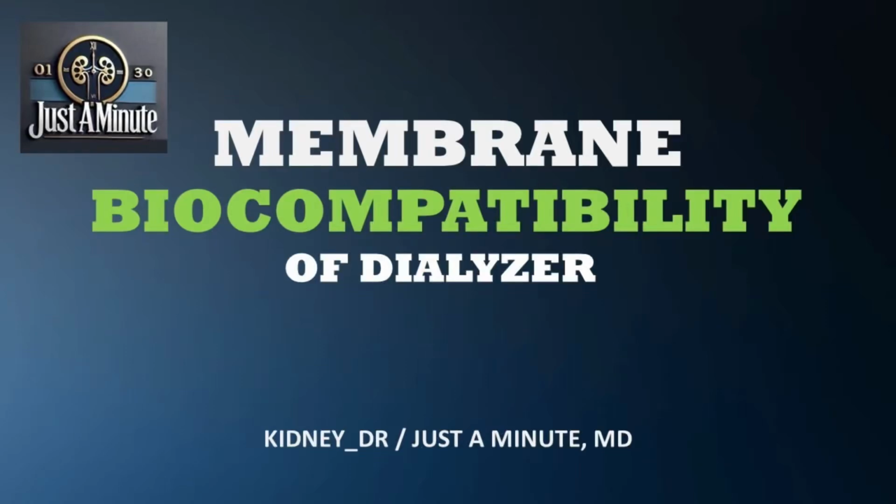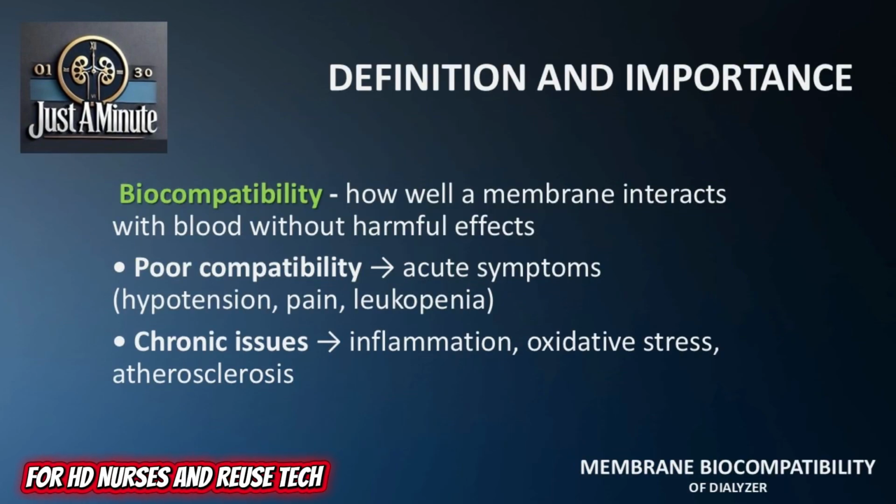Today we'll discuss the membrane biocompatibility of dialyzers. This topic is essential in understanding how dialyzer design affects both short-term safety and long-term patient outcomes. Biocompatibility refers to how well a dialyzer membrane interacts with blood without causing harmful immune or clotting responses.